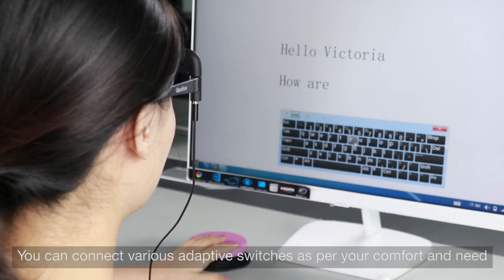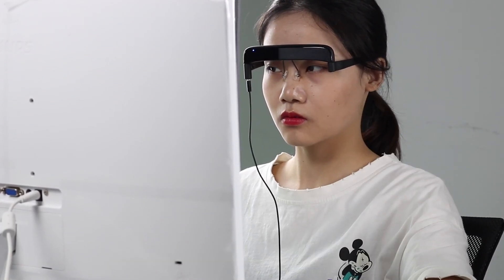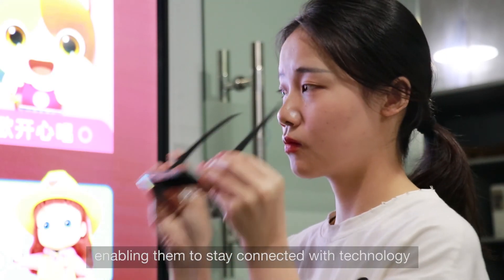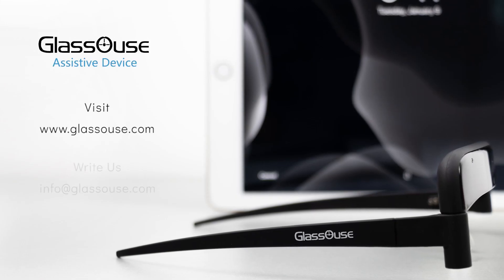You can connect various adaptive switches as per your comfort and need, and use them to make clicks on the device. GlassOuse has been used by thousands of people around the world, enabling them to stay connected with technology and use it to carry on with their work.